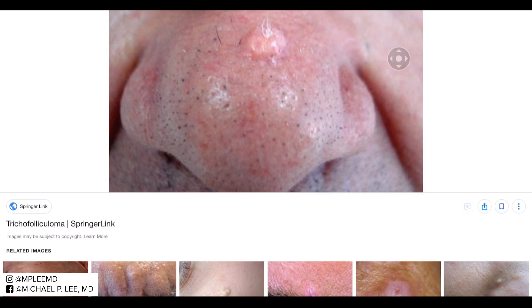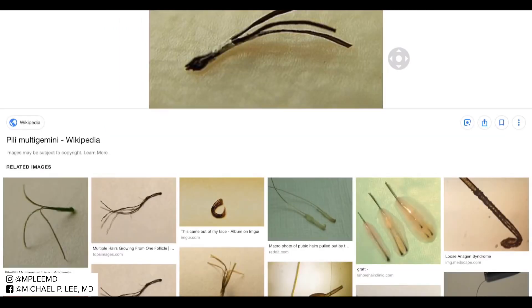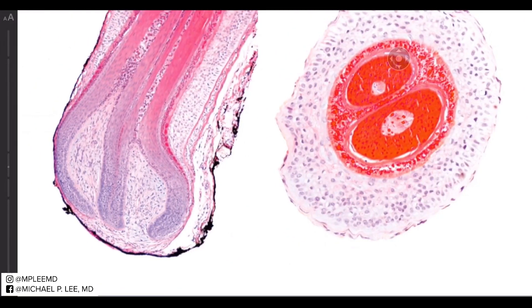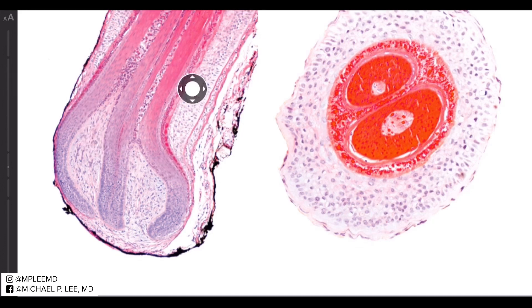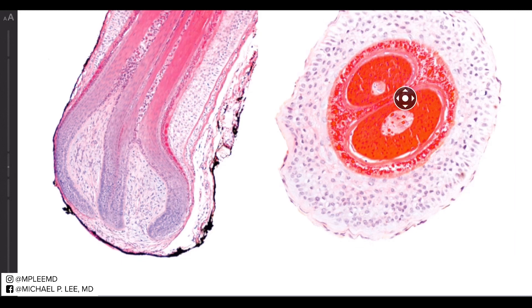One would think about something like Pili multigemini — that's multiple hair shafts coming out of one follicular structure. This is the H&E of Pili multigemini, and you can see multiple hair shafts all contained within one follicular canal: one outer root sheath, but multiple hair shafts coming in and out.